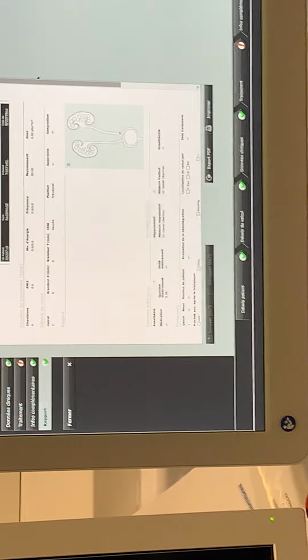Now we are. Good. The patient is on the table. Your technician drove the table to the start lithotripsy position, and in that position, you can start. Could we do that from here? Yeah, we could do that from here, and this is something I would like to show you now. We are now at Stone Base, but we cannot operate anything from Stone Base. That's why we need to go to Stone Touch.